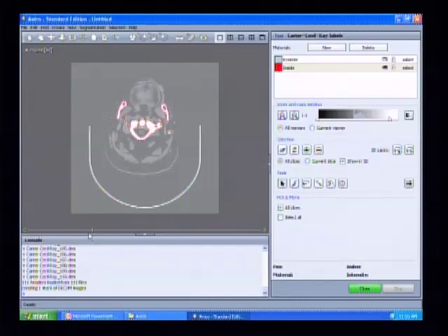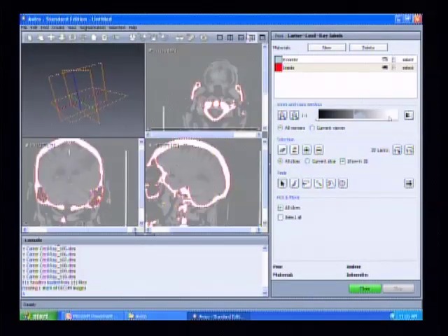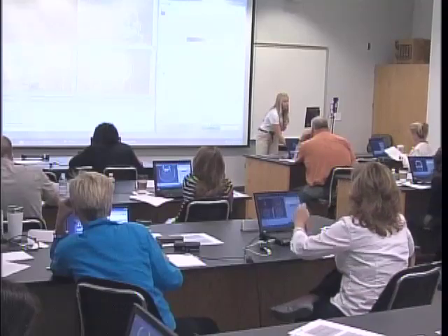Question. Sure. If you click on a selected area, but you didn't mean to, how do you unhighlight it? You can just click this eraser button, or clear. The letter C on your keyboard also means clear, so you can just click that clear button as well.